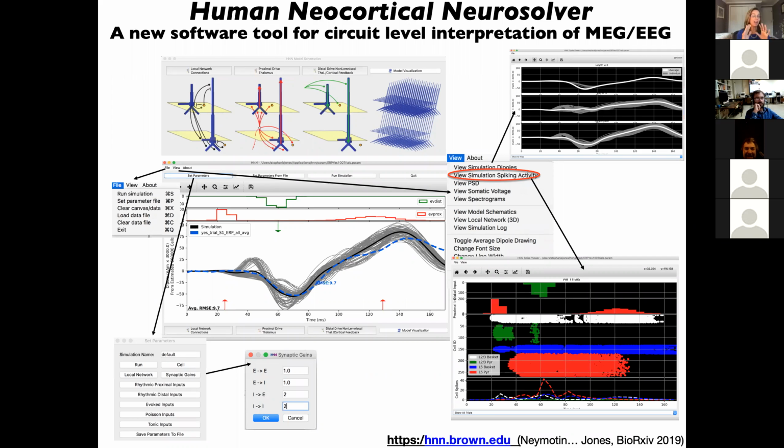If we can create HNN so that you can use NetPyNE models, then we could address your question more readily, because we could create a model that has the right connectivity structure to look at wave patterns of activity. But right now, that's not possible in the model that's distributed with HNN.